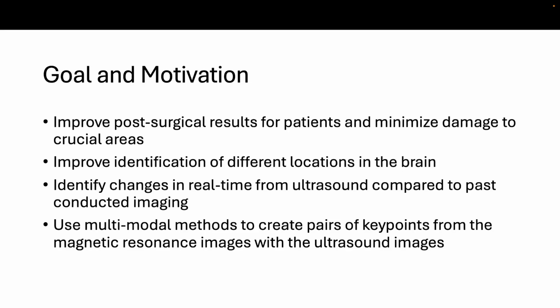So the goal and motivation of this paper was to improve post-surgical results and minimize damage, and to see if there are better ways of identifying different locations within the brain, as well as combine these two different methods of imaging and match them to each other, so you can tell where one area on one image is relative to the other area on the other image.